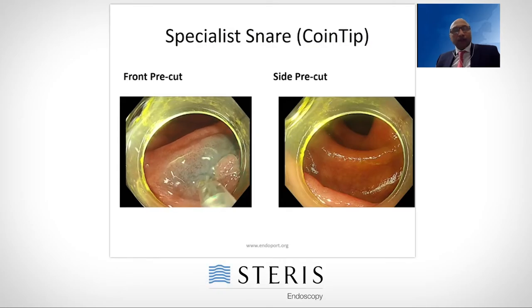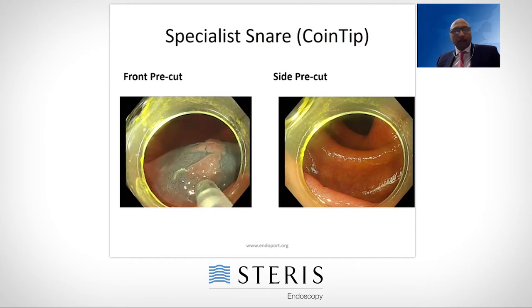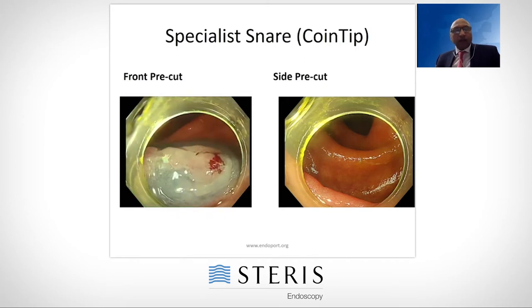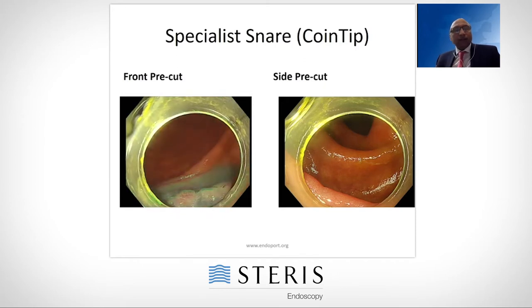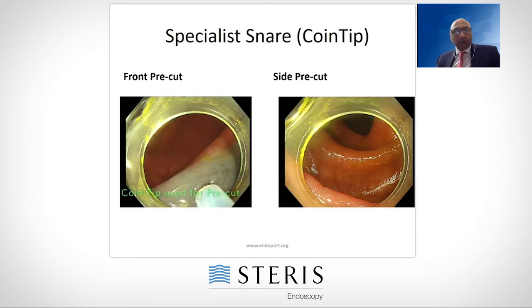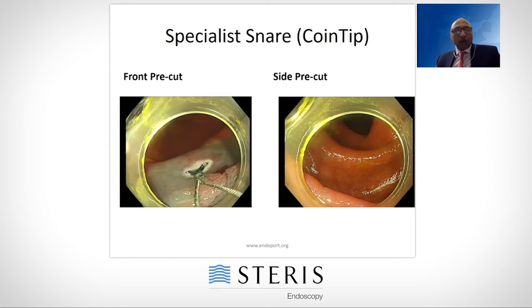I'm using this coin tip snare in a different way — we're going to do hot EMR. This is a strange polyp, almost like three different polyps next to each other. We lift them. The tip of this coin tip snare bends downwards a little bit, and that gives me the added advantage of using the tip to do a small pre-cut. I lift the mucosa enough, bring the snare back just exposing the tip, and use the cutting current to perform a little pre-cut in the mucosa.